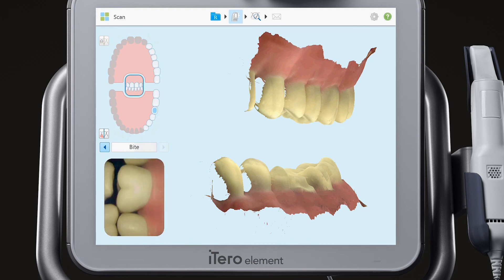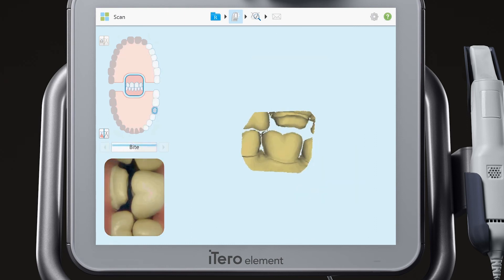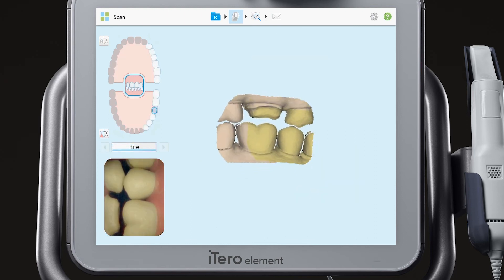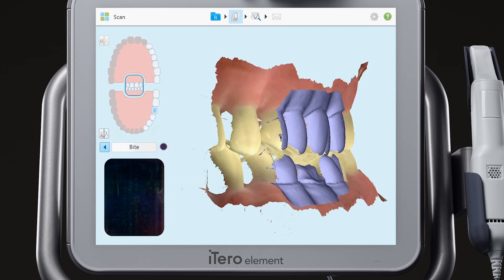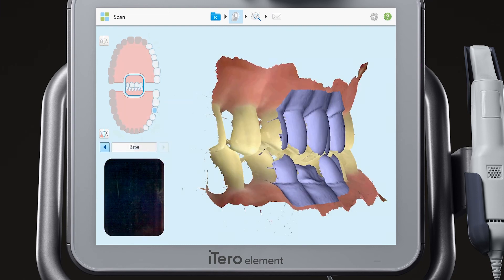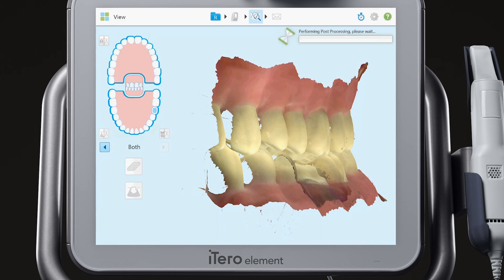Scan the bite, ensuring that the patient is biting in proper occlusion. When scanning the bite, move in a wave-like motion anteriorly to capture three to four teeth and the upper and lower gingival tissue. Tap on the view icon.